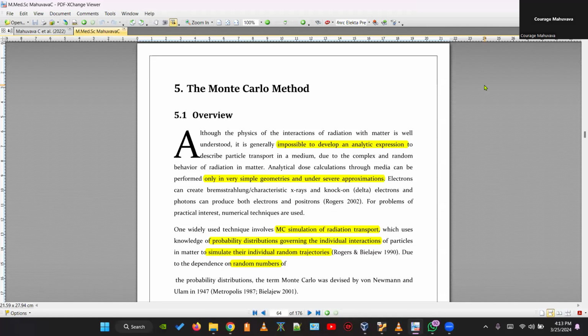And for the linear accelerator, the radiation is generated based on accelerating electrons to high kinetic energies. So you can then treat the patient using electrons, or you can direct those electrons onto a target, and then Bremsstrahlung radiation is produced that you are going to use to treat the patient in photon mode, right?